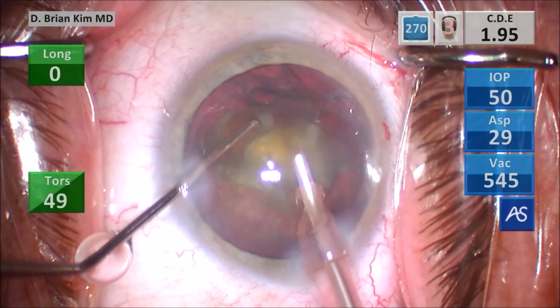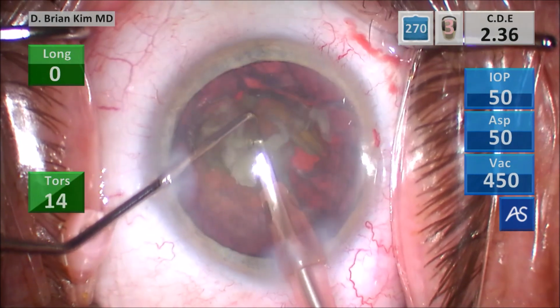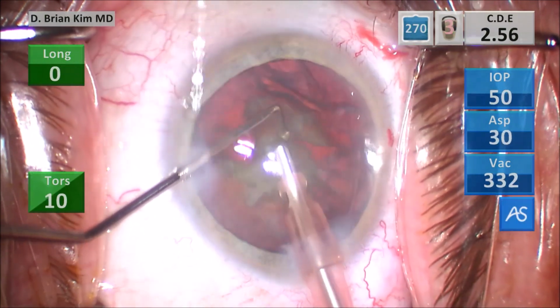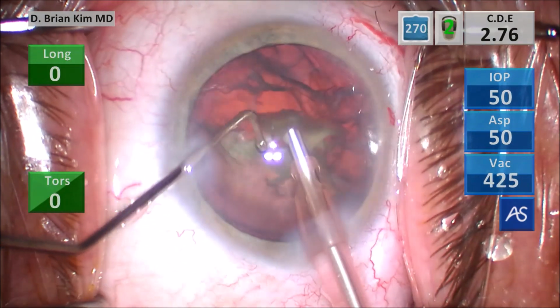I can spin it. You've seen me in my other videos using other techniques to mobilize that second stuck heminucleus, but I feel good about being able to just use a little ultrasonic energy, grabbing it with some vacuum and then lifting it up out of the bag. Because you don't want to create any more torsional stress on the lens.